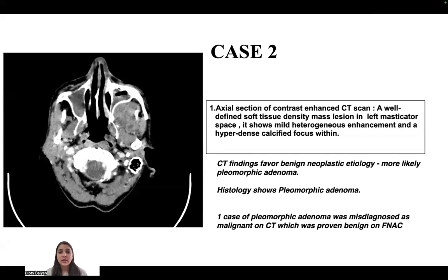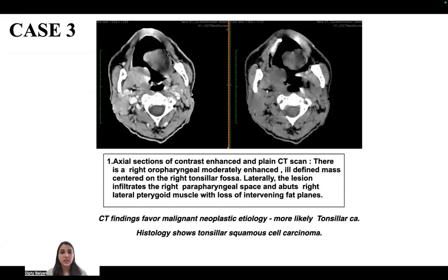In the second case, a well-defined soft tissue density mass lesion in the left masticator space shows mild heterogeneous enhancement and a hyperdense calcified focus within. CT findings were consistent with a benign neoplastic etiology, most likely pleomorphic adenoma. Histopathology also showed pleomorphic adenoma. One case of pleomorphic adenoma was misdiagnosed as malignant on CT, which was proven benign on FNAC.